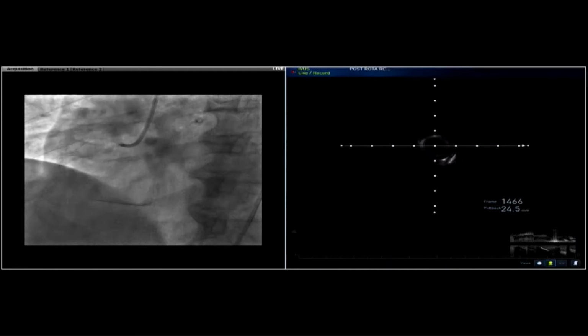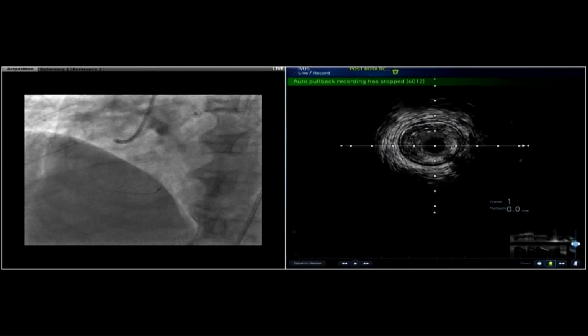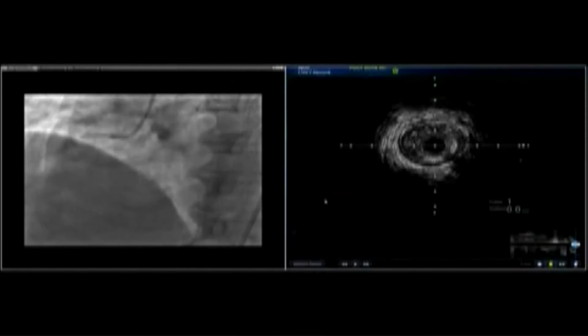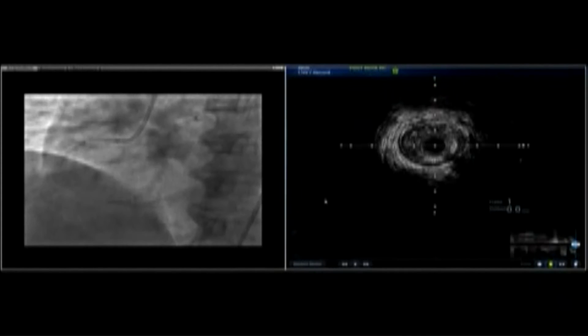Yeah, because for efficiency, Kirti, if you're able to open it with something, you already have your guide extension, then you probably can do lithotripsy, and you may just be able to proceed. But it's up to you, obviously. So that's not the algorithm I follow.